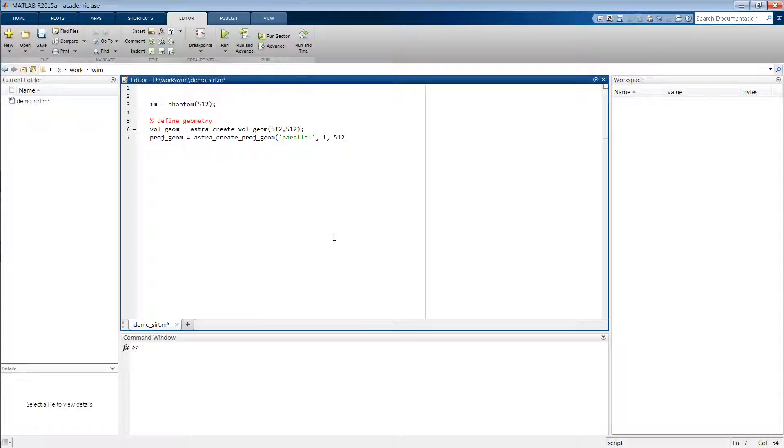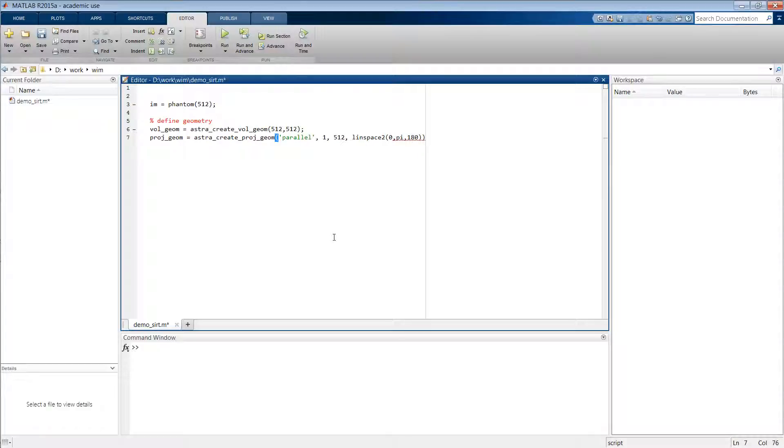We want there to be 512 detectors in each direction, and then we want to have 180 projections equiangularly spaced between 0 and 180 degrees.